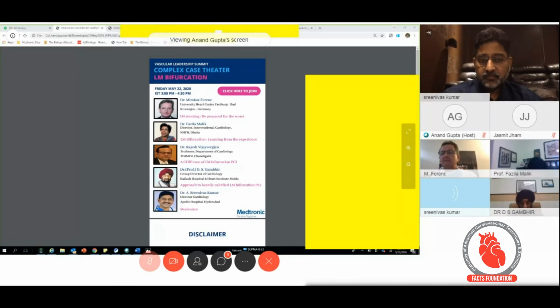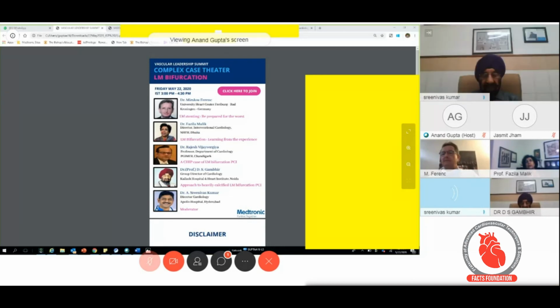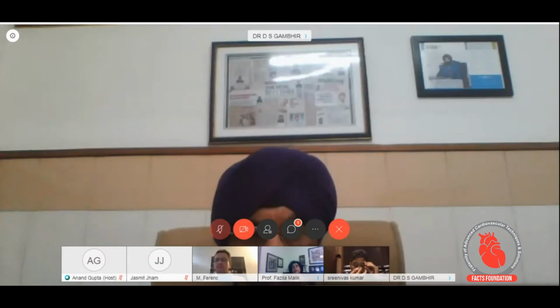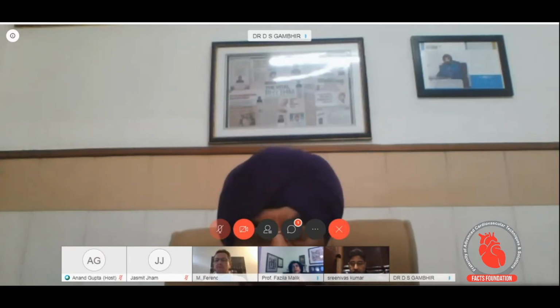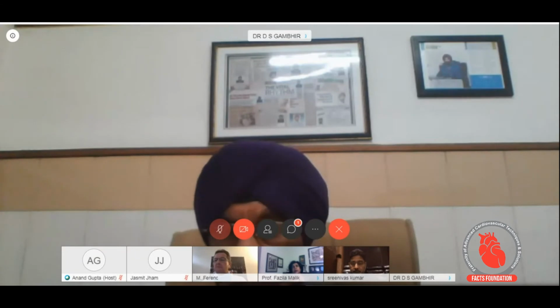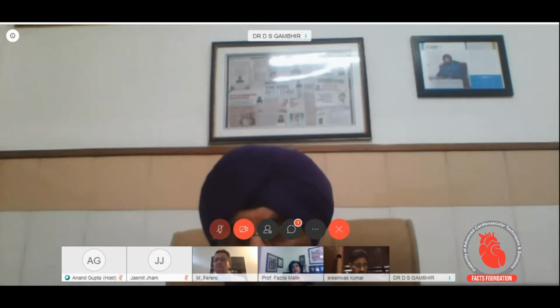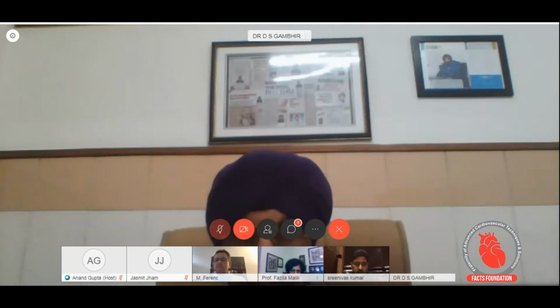Srinivas, yes, I do agree with our friend from Germany. The only point I would like to highlight here is, of course, I would certainly not like to stent the ostium if it is free of disease. I would start only a millimeter proximal to the point from where the lesion is starting. That means if it's in the mid LAD, I start only from the mid LAD. I just put the stent 1 or 2 millimeters proximal to the start of the lesion, not the ostium.